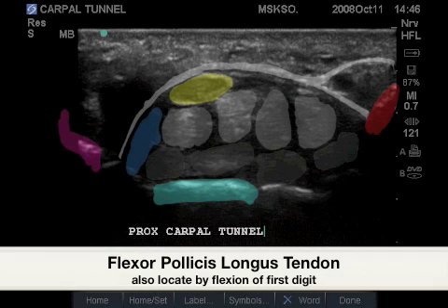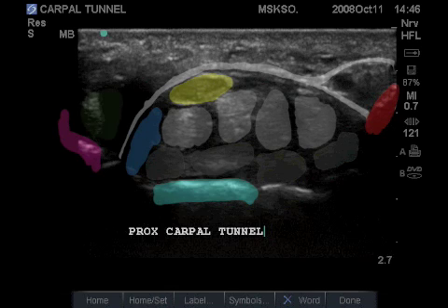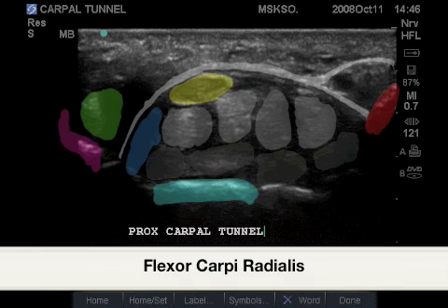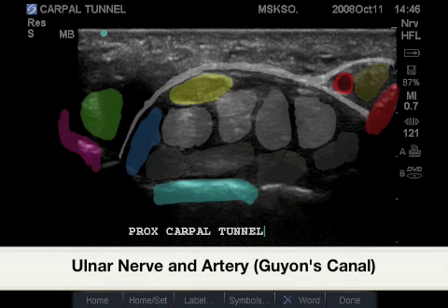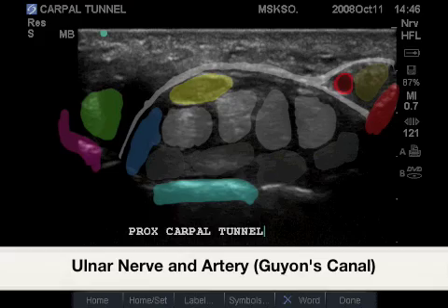In blue on the far radial aspect bordering the scaphoid is the flexor pollicis longus and flexor carpi radialis, and the ulnar nerve and ulnar artery, creating Guyon's canal.